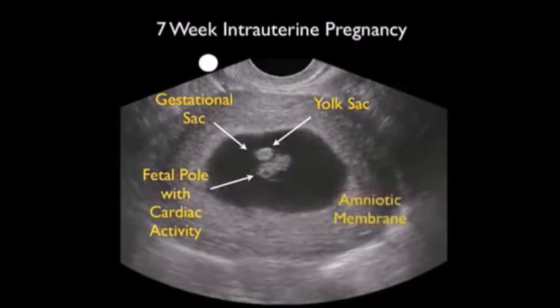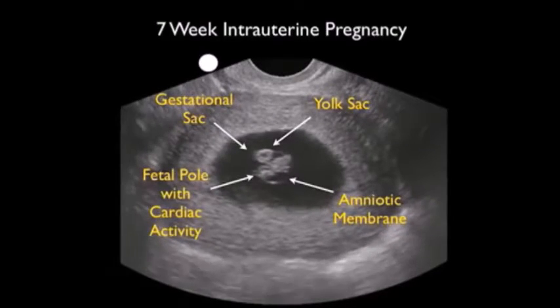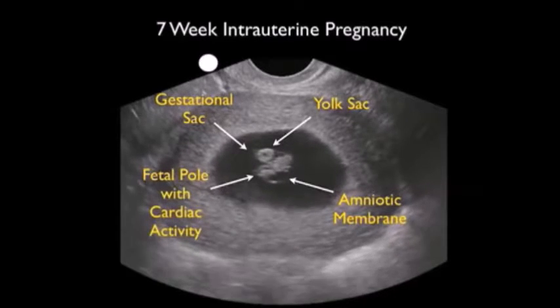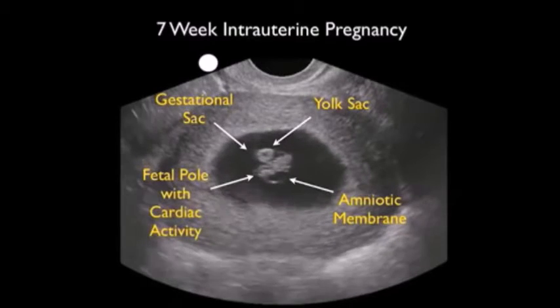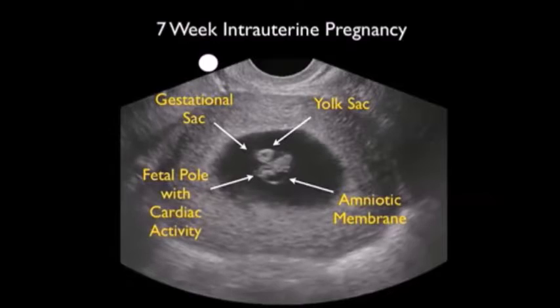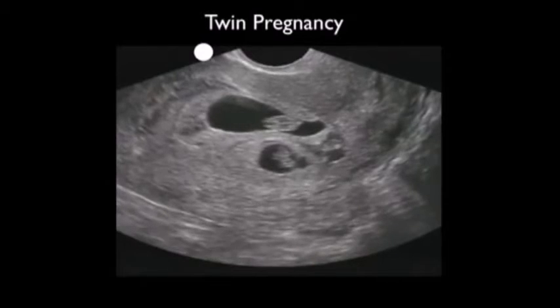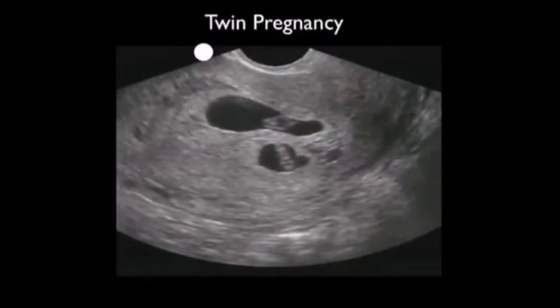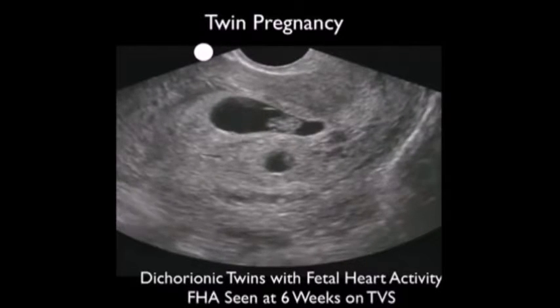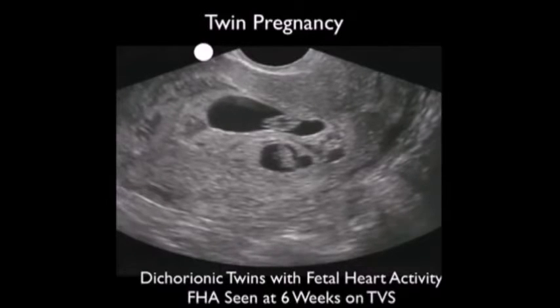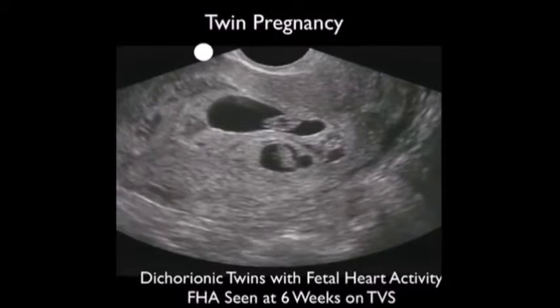We also see another very important finding here: the amniotic membrane billowing out from around the fetal pole. Eventually the amniotic membrane will plaster down on the margins of the gestational sac to form the amniotic cavity in which further growth of the fetus will occur. Here's an interesting video clip showing a twin pregnancy — two gestational sacs signifying dichorionic twins, with little fetal poles and a flicker of heartbeats visible within each sac. Fetal heart activity is seen at about 6 weeks on transvaginal sonography and about 7 weeks on transabdominal sonography.